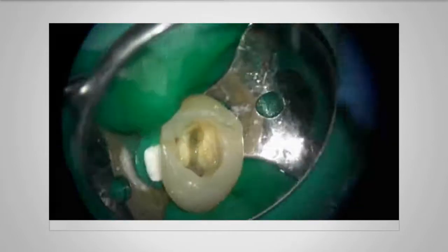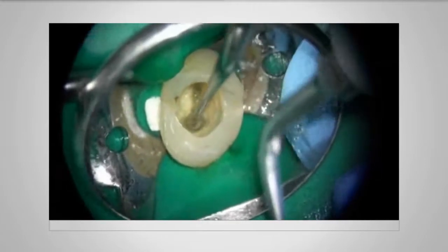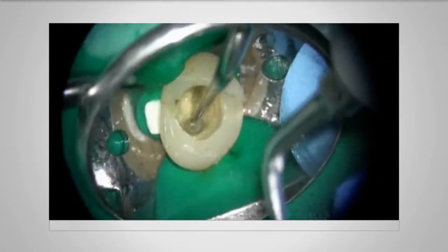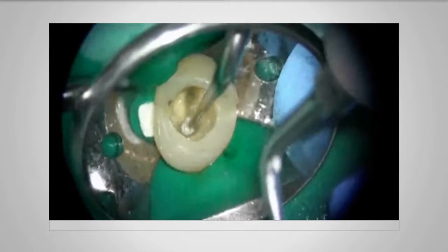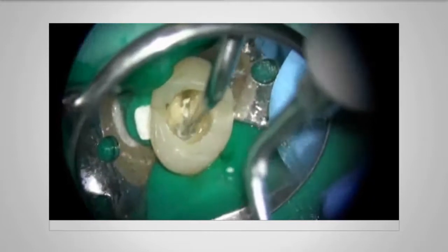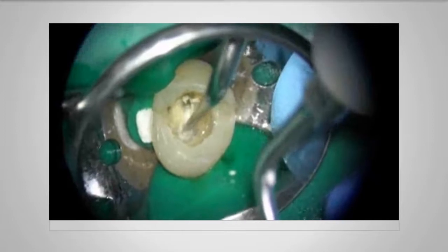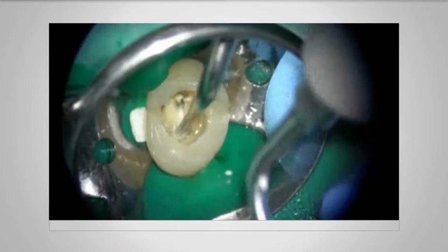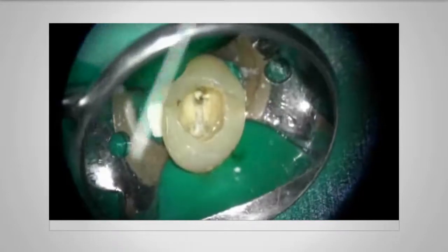We're now looking down onto the pulp floor and using an ultrasonic tip called a Start-X tip, number 3, we're going to remove calcification from the coronal aspect where we anticipate the orifice of the root canal to be. I'm also chasing this through the isthmus between where the two canals are. Flushing with sodium hypochlorite.